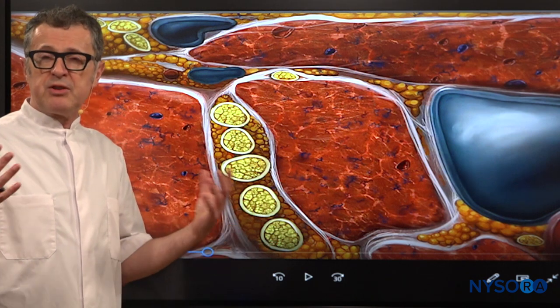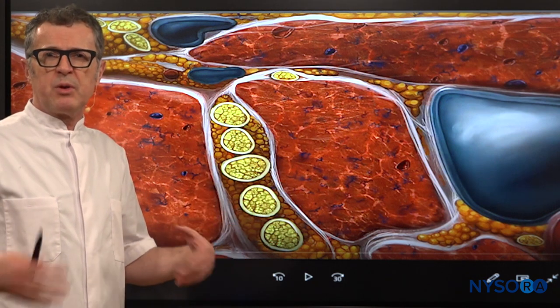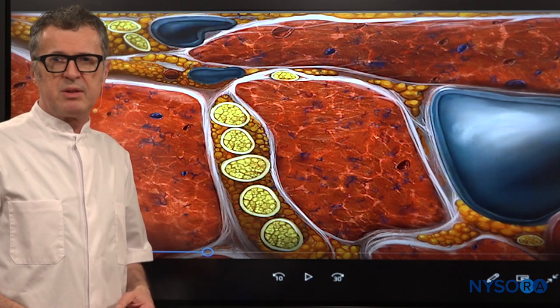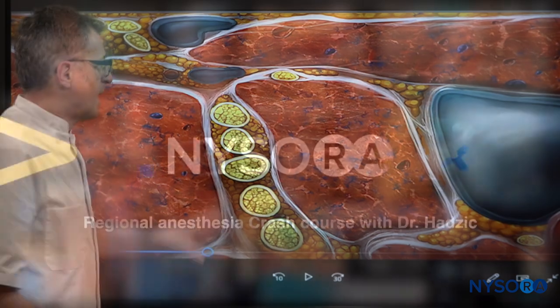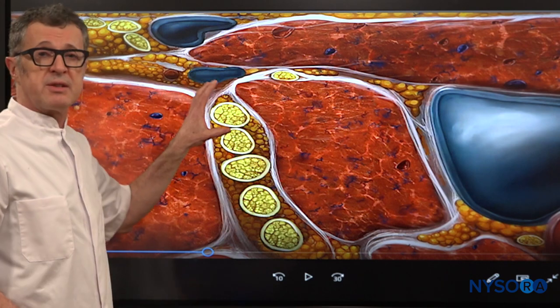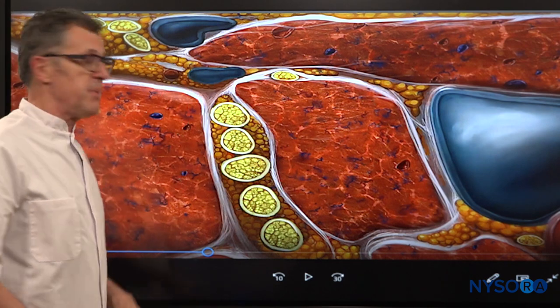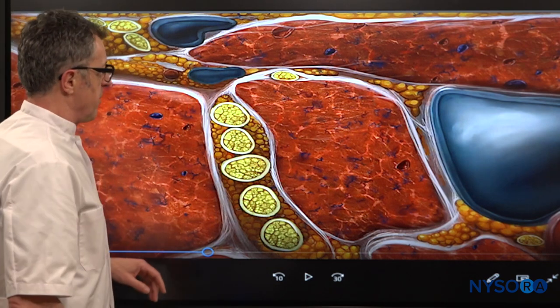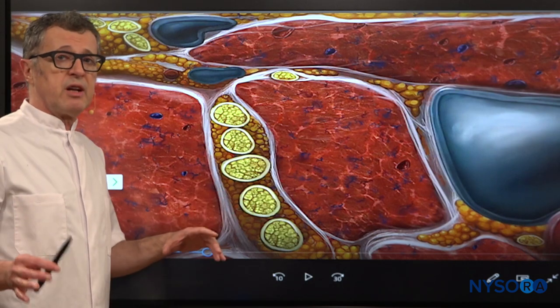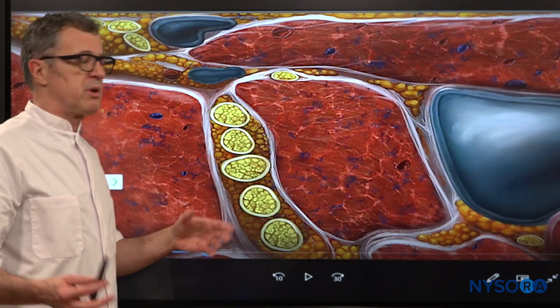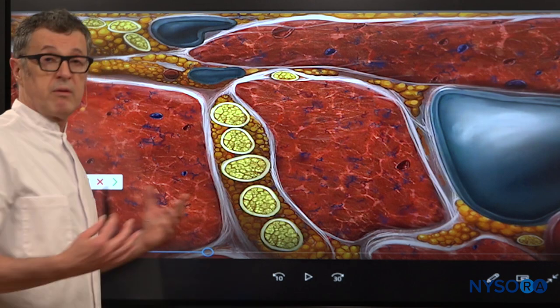Let's discuss one of the potential mechanisms of nerve injury during the interscalene brachial plexus block. We're going to use an Isaurus reverse ultrasound anatomy animation to explain what can potentially happen. Before we get started, let us briefly discuss some of the anatomical elements that are important.